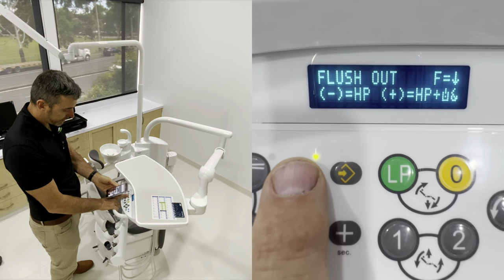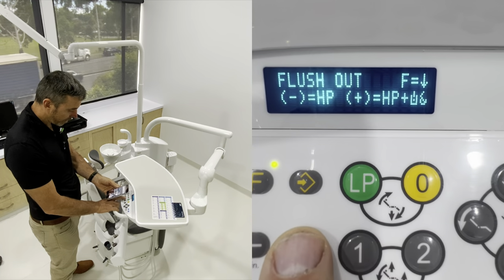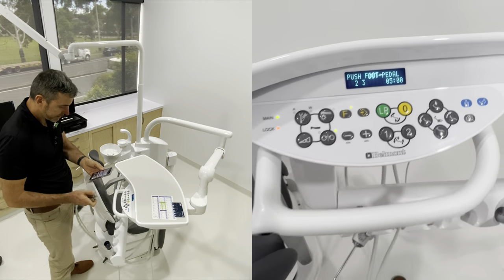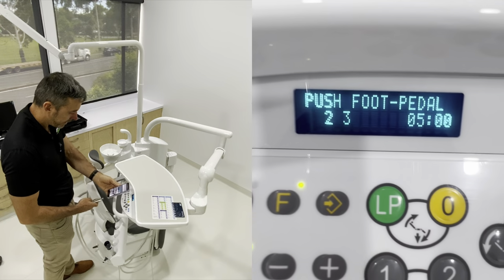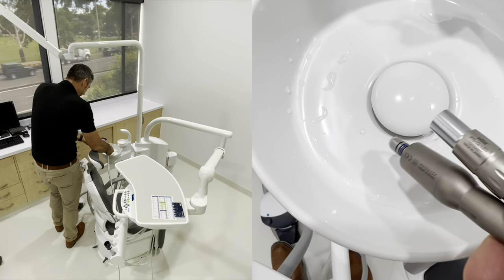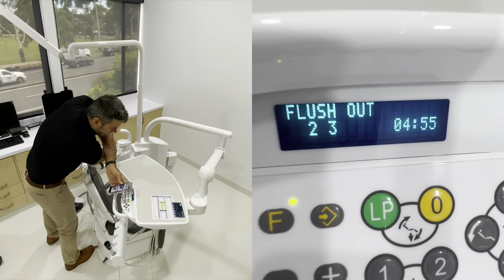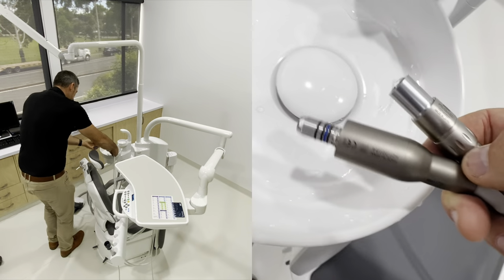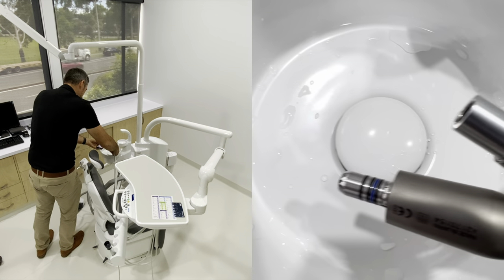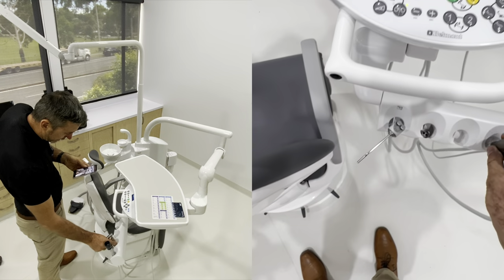Next function is flush out - this is something you should be using every day. Hit the plus for a long flush out of five minutes. Take those handpiece lines out and it tells you which hangers you've removed. Hit the foot panel and it'll flush and time down for about five minutes, pushing water through all of those lines. If you want to stop it early, just hit that foot panel again and it stops.